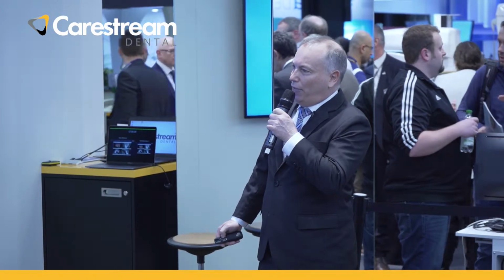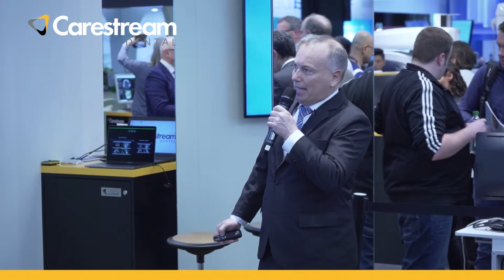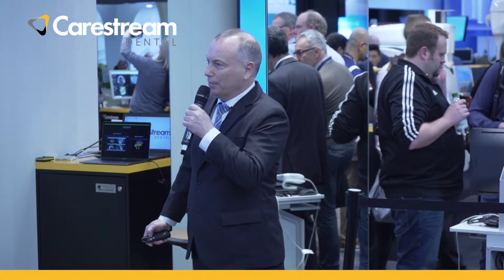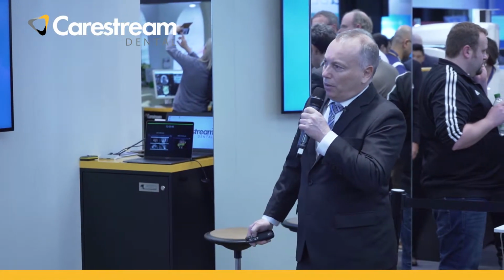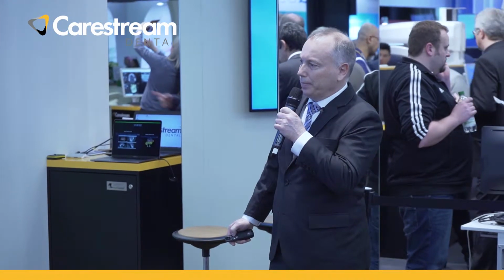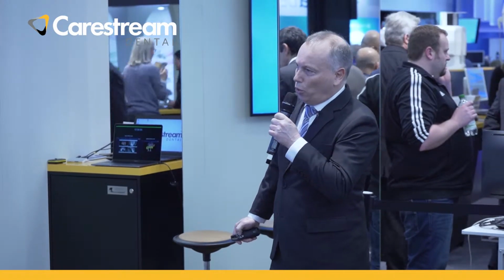You see that we have enough bone to place these implants. This is for tooth number 2-1. We can turn and check the volume. We can show the wax-up.